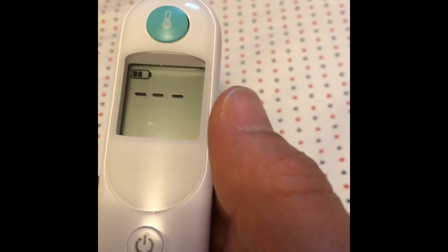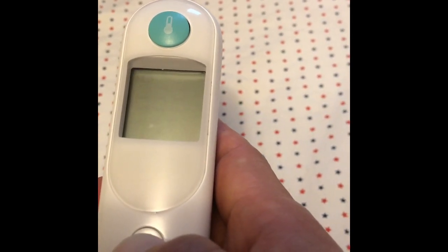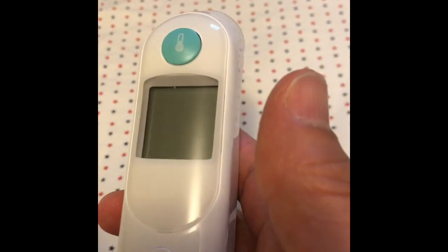Which is the mode I'm using right now. I turn it off. So that's how you toggle from Fahrenheit to Celsius mode.